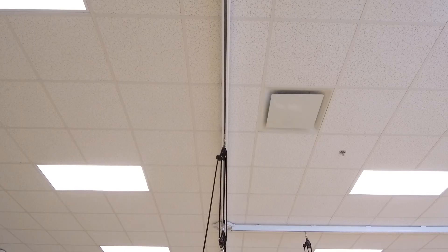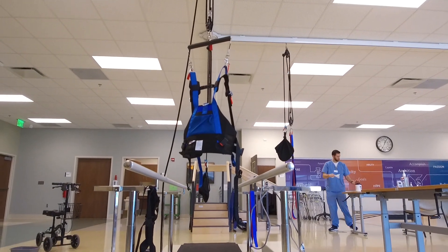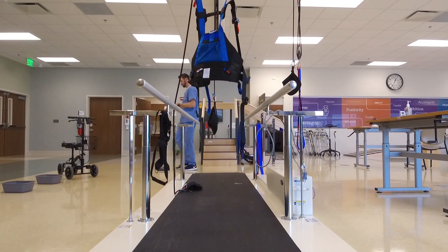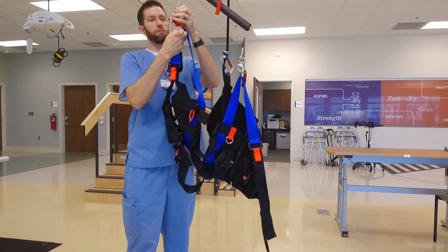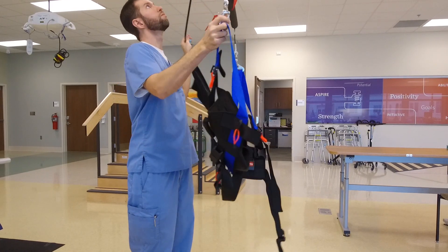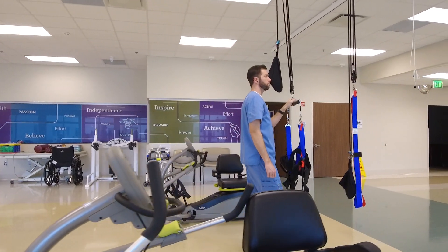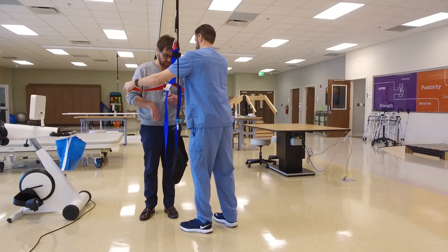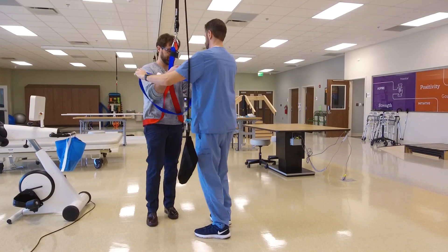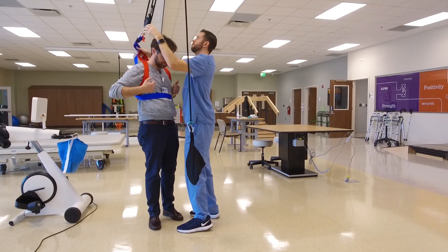The FreeStep overhead harness system allows us to safely engage our patients in higher-level activities without worrying about them falling. It leaves our hands free so we can stimulate the muscle groups we want them to activate. We can better manage their limbs when they can't manage them themselves — like after a stroke — in a safe way that relieves them of their fear of falling. They're in a harness system that allows them to work their reactive responses in a way that we just couldn't do without it.